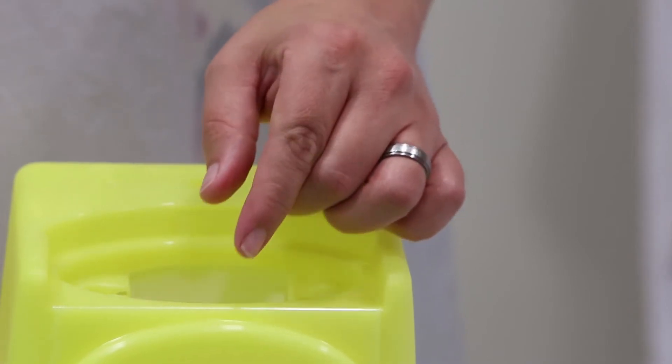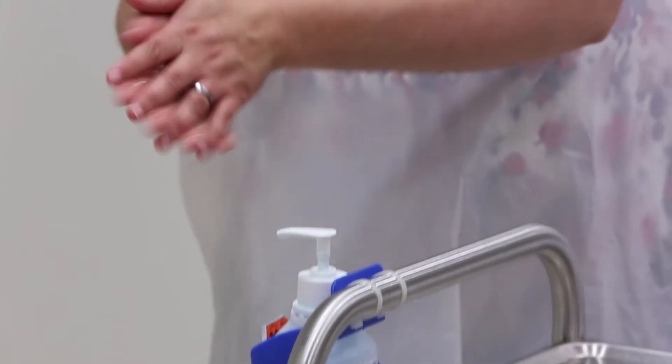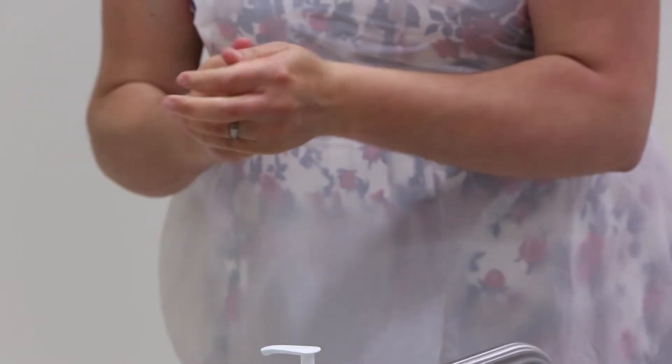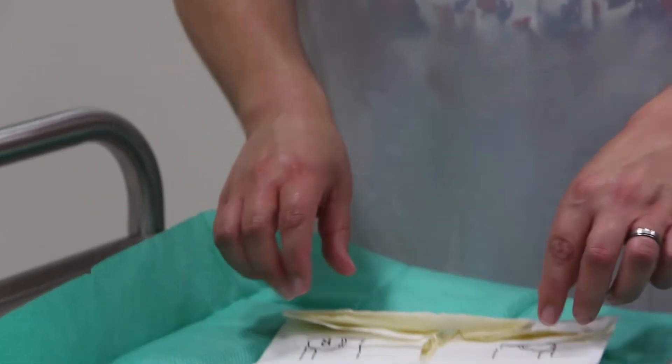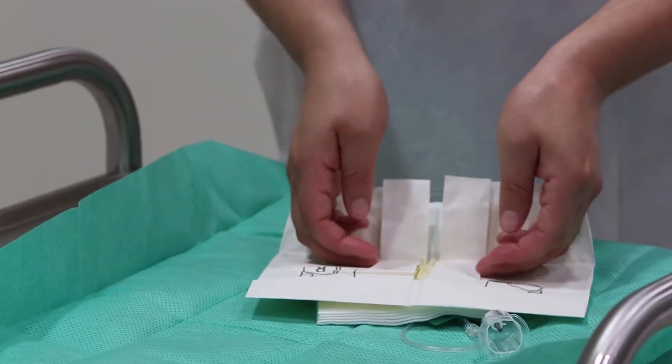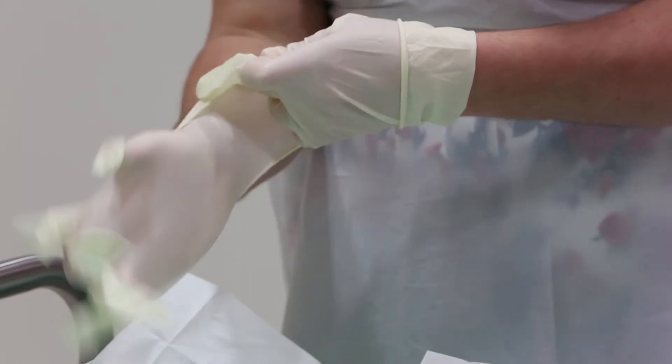Discard used applicator into the sharps box. Perform hand hygiene once again and allow your hands to dry. Now, put on the sterile gloves to maintain sterility in case you would need to repalpate for the patient's vein.